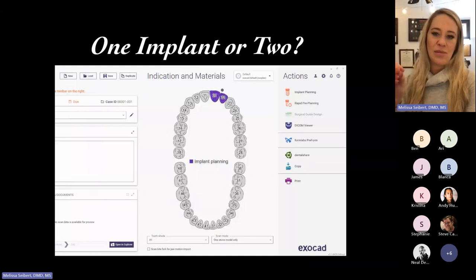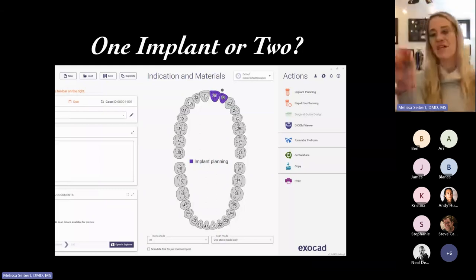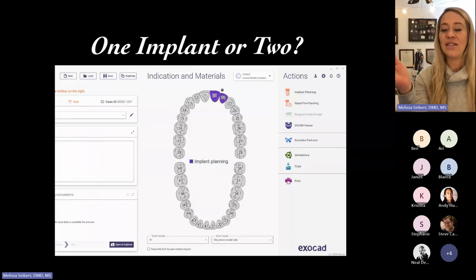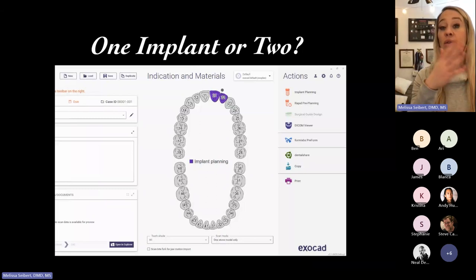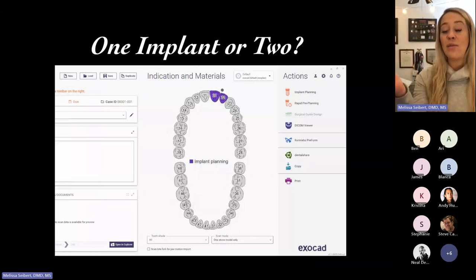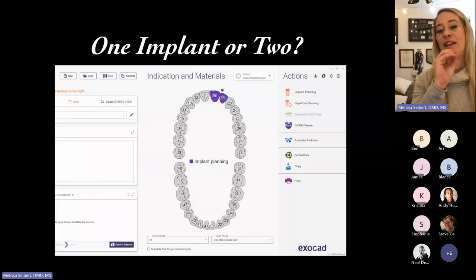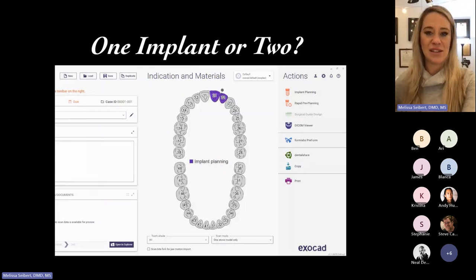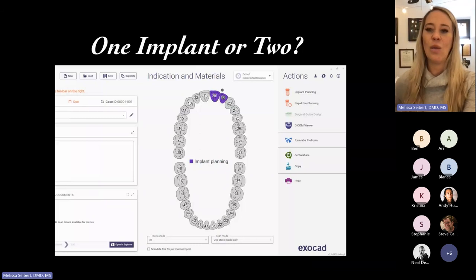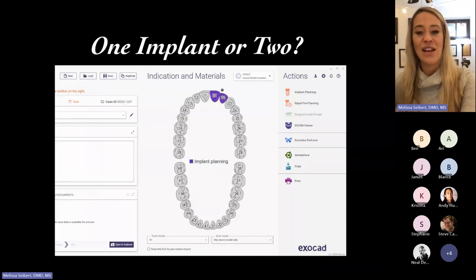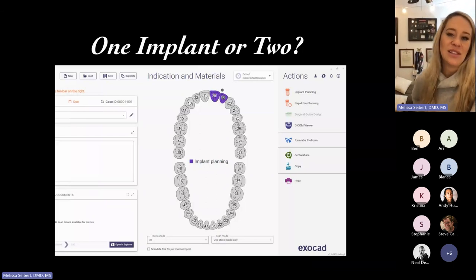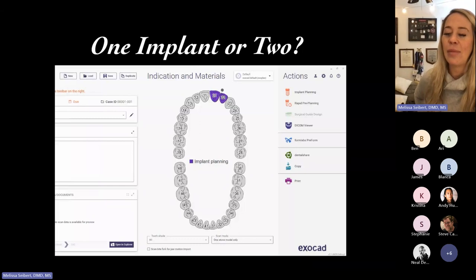The question in this case, when it came to implant planning, was determining whether to do one or two implants. After all, the patient is missing two teeth. We have the option of placing two implants, doing no implants at all and using resin-bonded FPDs, doing one implant and cantilevering the pontic off of that, or doing one implant combined with a resin-bonded FPD. Oftentimes it becomes a challenge fitting two implants and achieving good papilla fill because you need just the right distance and positioning. I used the rapid pre-planning feature in ExoCAD so it wouldn't be a surprise the day of surgery.